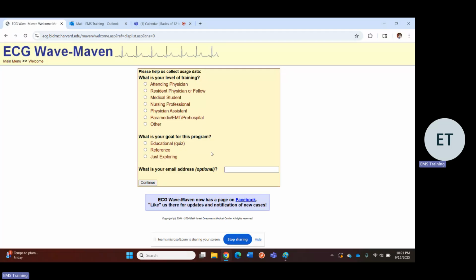I like to take more of a conceptual approach. Do you have to memorize what the intervals should be, your PR interval, your QT, what QT prolongation is, what a wide QRS complex is? Yeah, you do. So there's that basic stuff. Do you have to memorize what a normal appearing EKG looks like? Yes, you should be familiar, not necessarily why, but looking at a 12 lead you can say either this looks normal or this looks abnormal for any reason. I would recommend memorizing what a normal 12 lead looks like. And this is something that I don't think people dedicate enough time to.